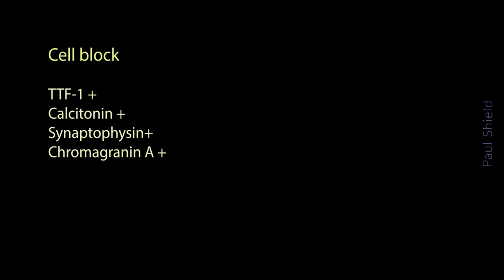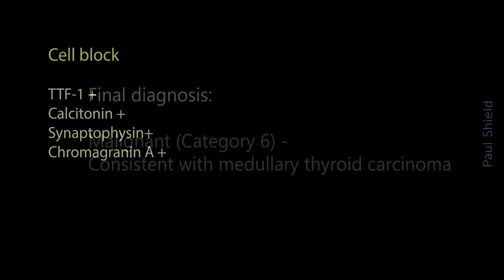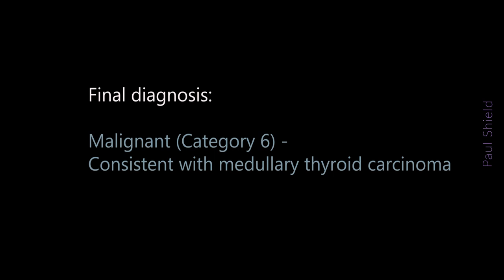We attempted a cell block on this, which proved to be very scanty, but it showed some spindle cells present, and these were positive for calcitonin, TTF1, synaptophysin, and chromogranin A. So the specimen was reported as category 6, malignant, consistent with medullary thyroid carcinoma.